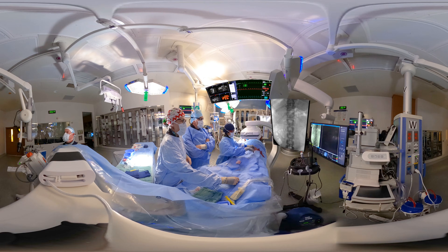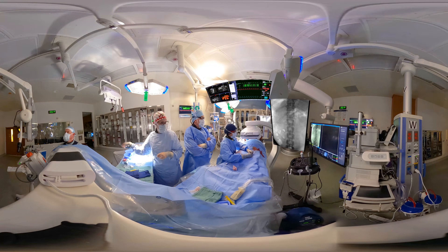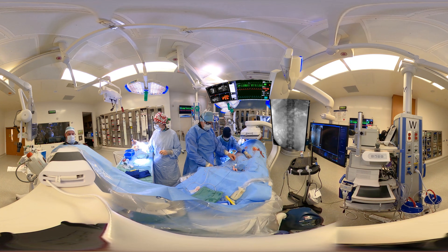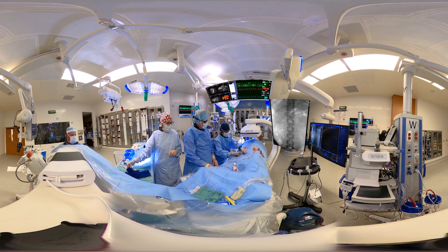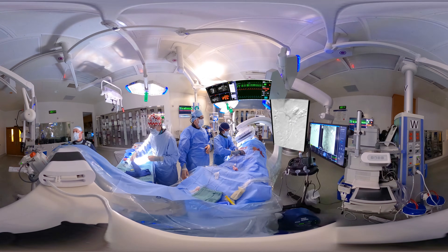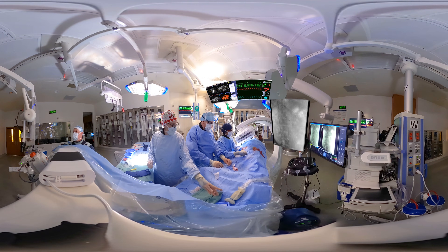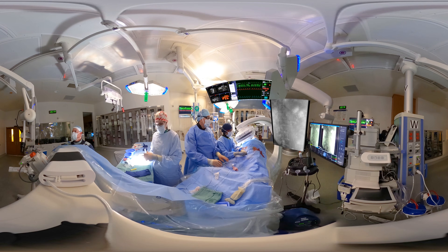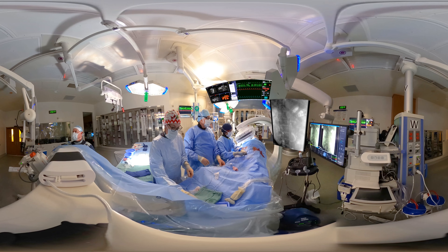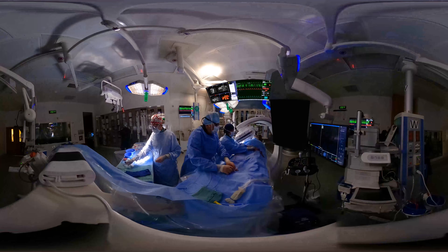You can see we've now punctured and are going in through the left femoral artery. We're taking the secondary catheter and looking for the celiac artery. We know from the pre-op MRA roughly what angle is needed to lay out the splenic artery, and here we're moving the image intensifier into that position. We've catheterized the celiac artery — now it's a matter of retaining the catheter, advancing the wire, and getting into the splenic artery.